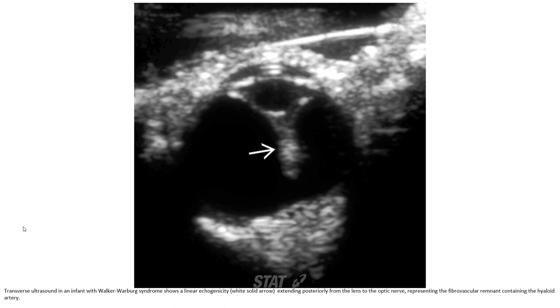This is a case of PHPV on ultrasound imaging. A linear echogenicity extending posteriorly from the lens to the optic nerve represents the fibrovascular stalk containing the hyaloid artery.